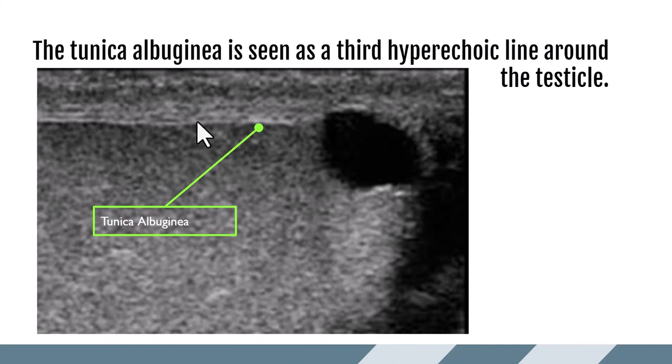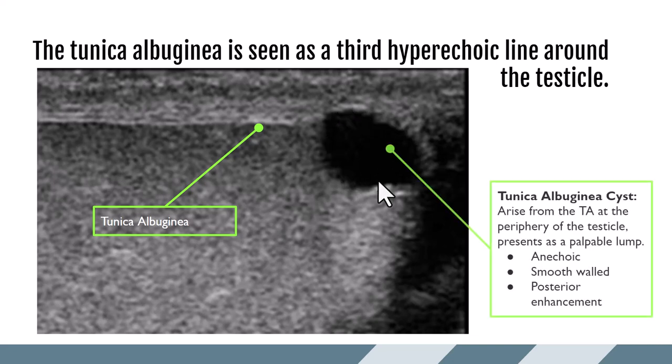The tunica albuginea is the third hyperechoic line in direct contact with the testicle. We have the parietal layer of tunica vaginalis, a little fluid, the visceral layer of tunica vaginalis, and then the next layer down — that third line — is the tunica albuginea. It is a very dense fibrous tissue that extends into the testicle creating scrotal septations, which are not individually appreciated by ultrasound. There is also a large anechoic area here — a tunica albuginea cyst. These are benign cysts arising from the tunica albuginea, usually seen right on the periphery just underneath it, appearing anechoic with smooth walls and posterior enhancement.